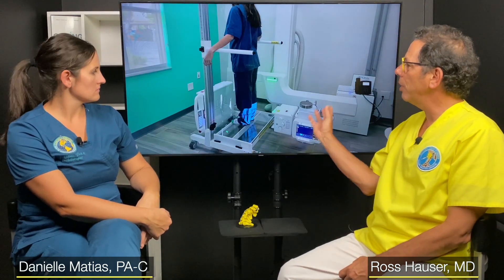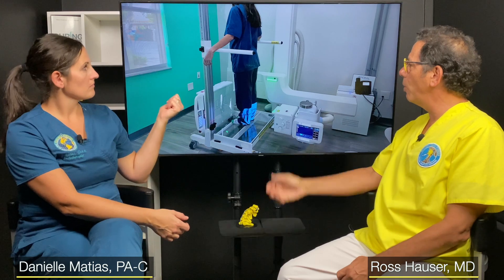People have chronic symptoms — they just know something's not right with their lower back, their knee. So much of the anxiety is not knowing, because they were recommended physical therapy, a certain kind of injection, and nothing worked. Some doctors even start hinting it's in their head. With motion x-ray, we can actually show them what the problem is.